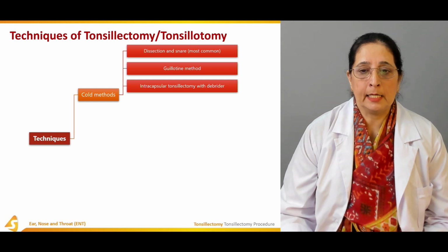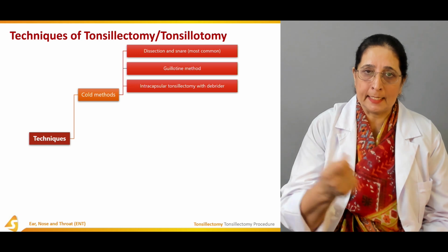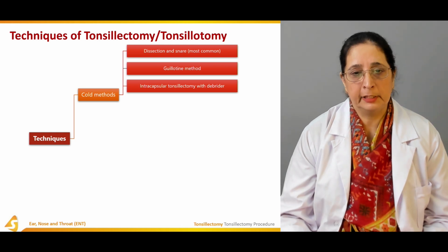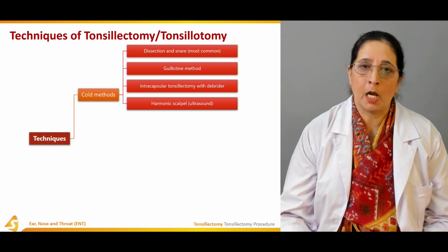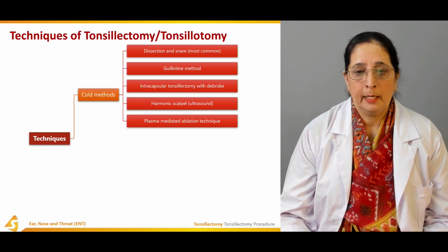Intracapsular tonsillectomy with a debrider: inside the capsule, tonsils are removed with the help of the debrider. Then the harmonic scalpel or ultrasound method of tonsillectomy.